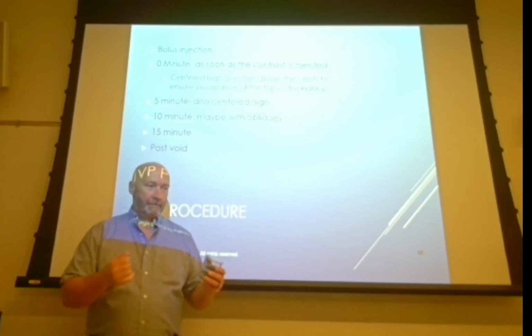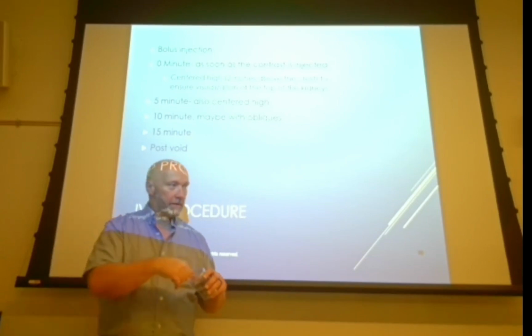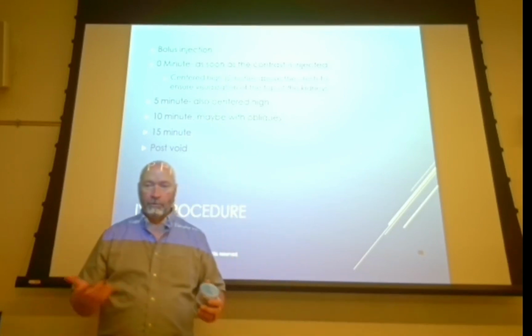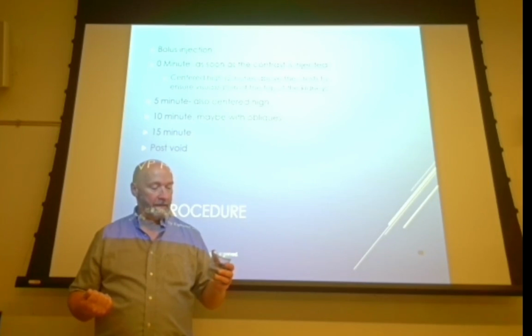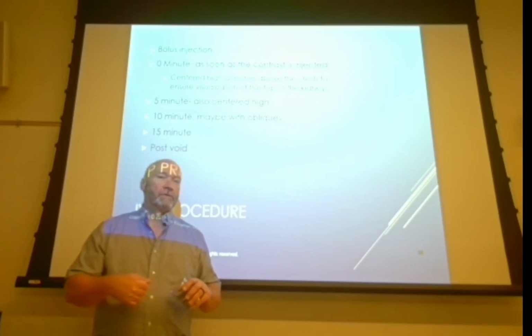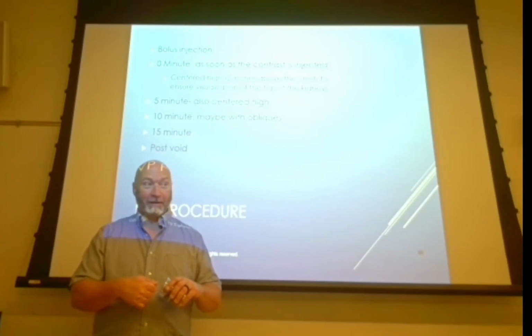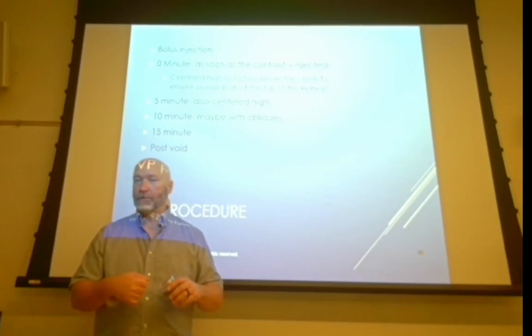So I'm doing this IVP on this patient. I'm getting ready to inject, and I take my 18 gauge needle and I'm going to poke it in this port. And I'm talking to my patient, just doing the normal stuff. And I look at my syringe with my needle, and I look at the port, and I put them together, and then I take my eyes off of what I'm doing. I'm talking to the patient again. So you start to push something, and you meet resistance. What do most of us do? Push a little harder, right? If you were smart, you'd stop. I wasn't. And I pushed a little bit harder.